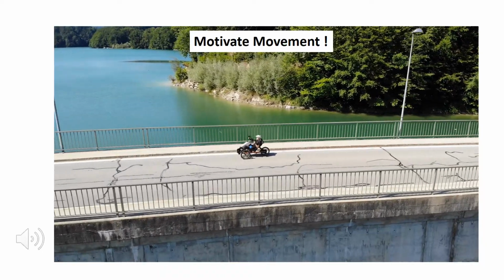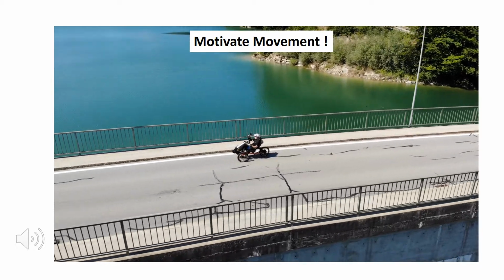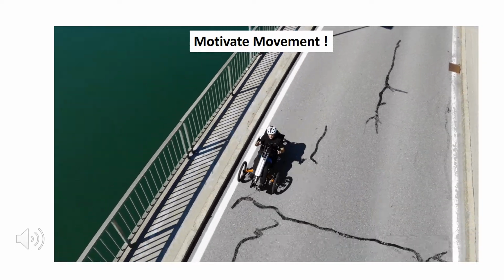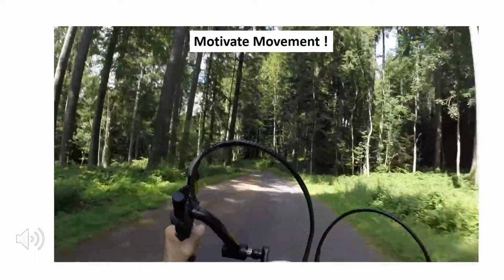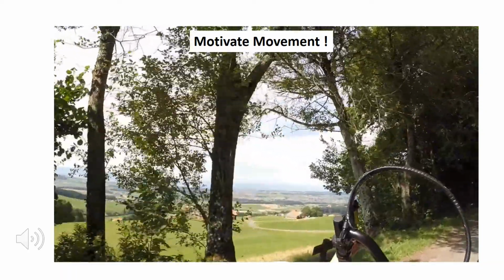Following up on the last slide, I show you here the exercise bike, the Go Trike, and Sebastian taking it outside and enjoying himself, having fun at the same time while he's doing his exercises and building his strength to further his improvement in walking.